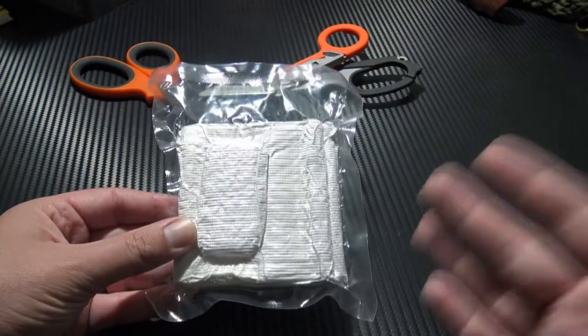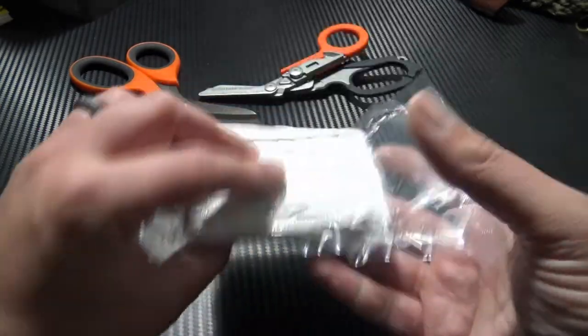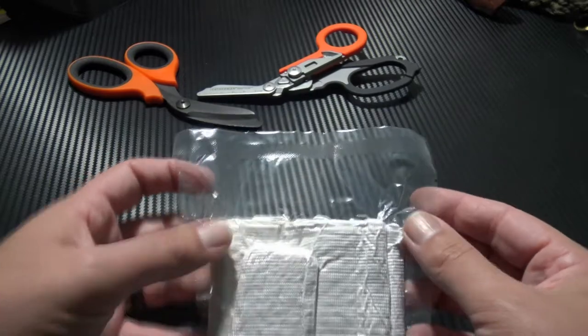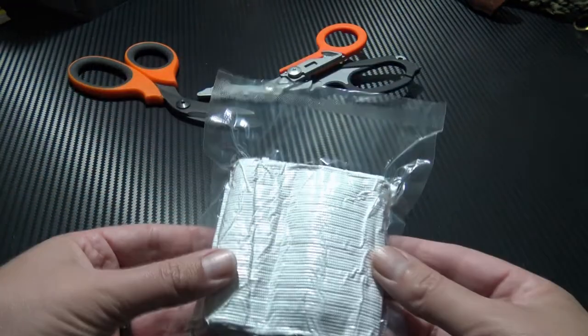Depending on your personal preference or perhaps your SAPs at work, these can actually be stored in this inner vacuum-packed configuration. It does save a couple of extra seconds getting it out of the outer packaging. There's a tear notch here, and you simply tear to get in.